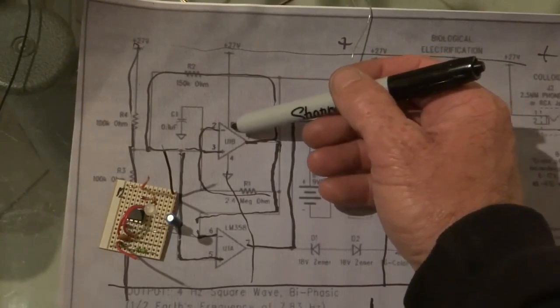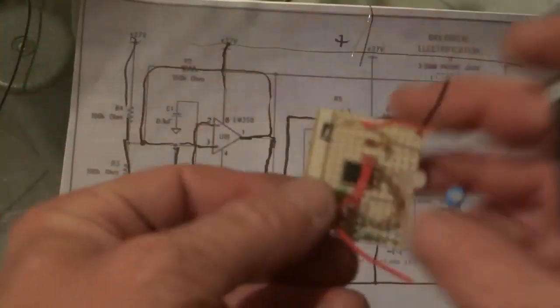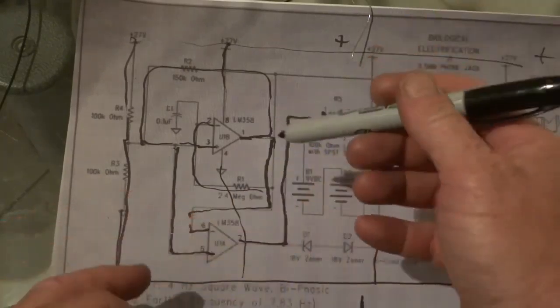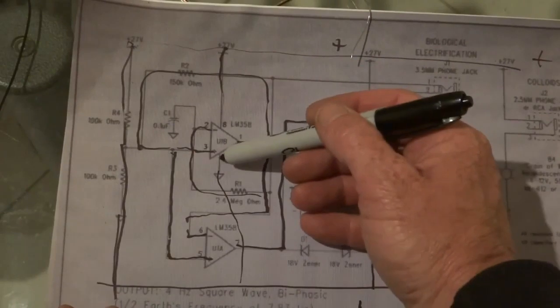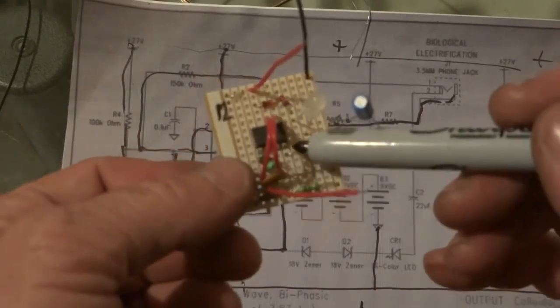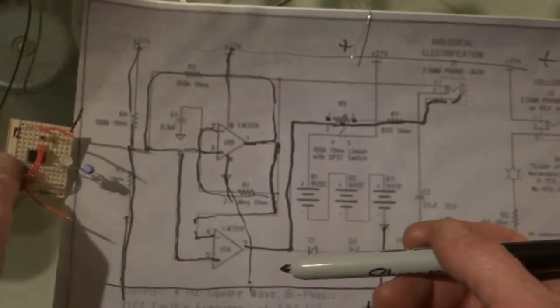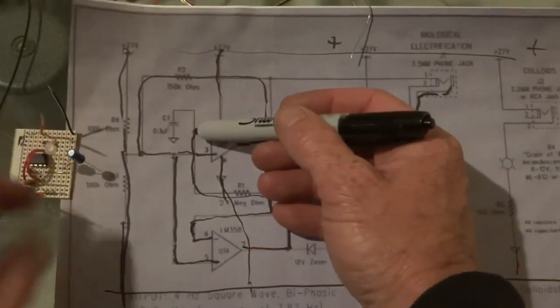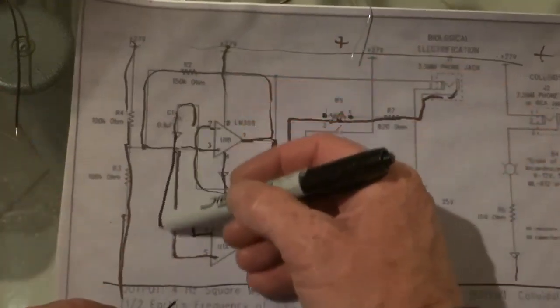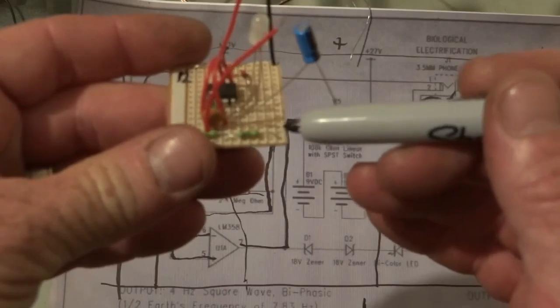This one here is number eight to the positive — that little pin we did from up here, number eight to the positive. Number four was this pin here to the negative — number four over to the negative. Those are the two pins that we cut. Then we have this one here, which is from number two — that little brown capacitor — which goes to the negative. Number two to the negative.